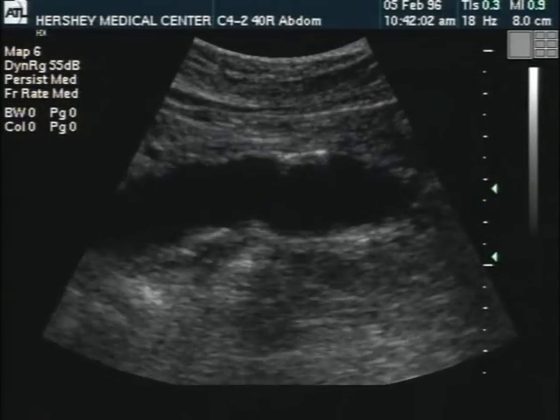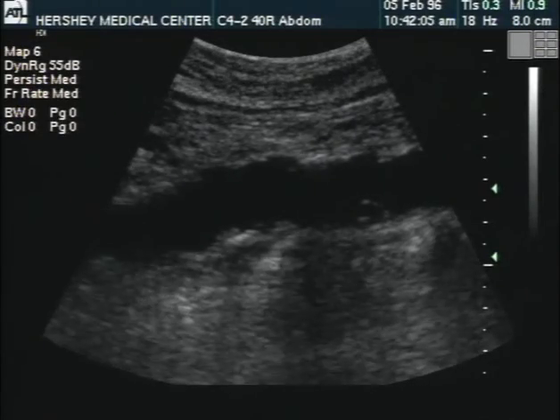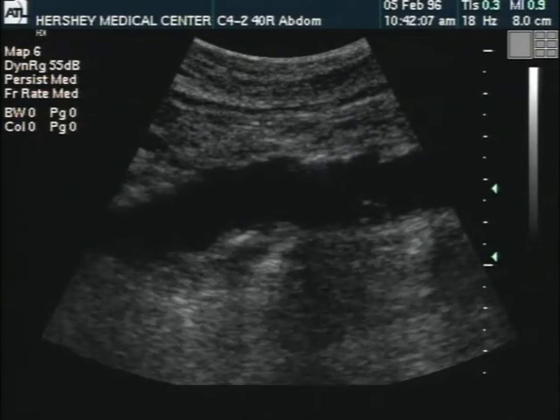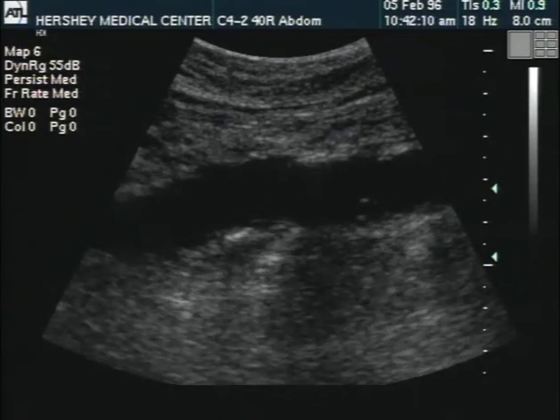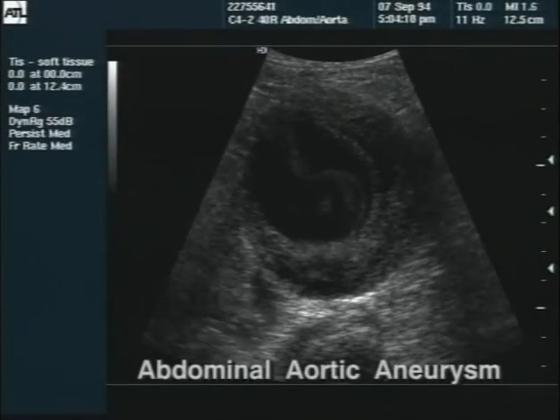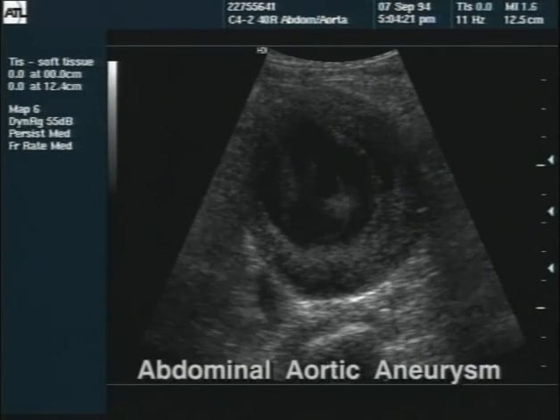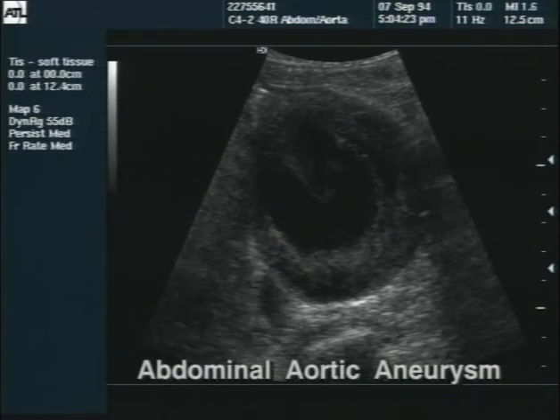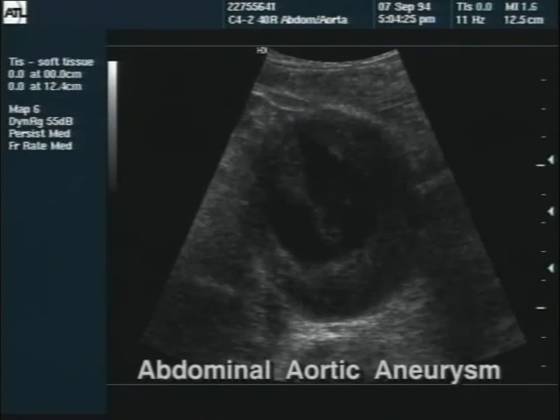Atherosclerotic stenosis of the aortic wall may cause focal increases in the peak systolic velocity. However, if the aorta is diseased due to severe atherosclerosis, aneurysm, or dissection, the peak systolic velocity may decrease.